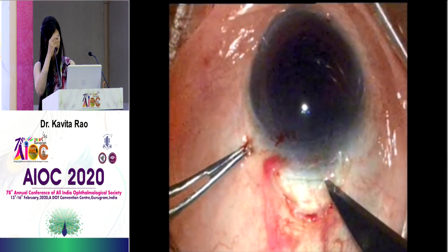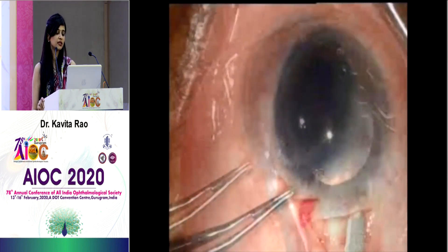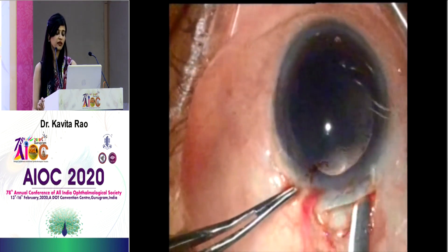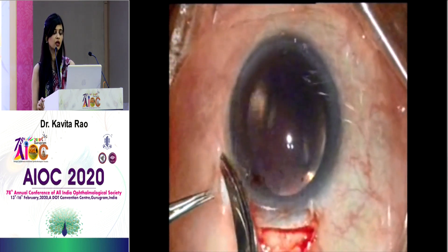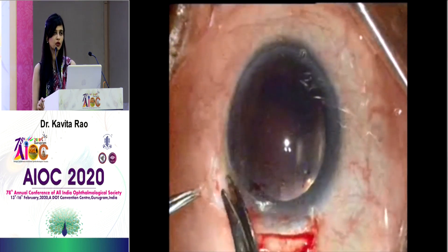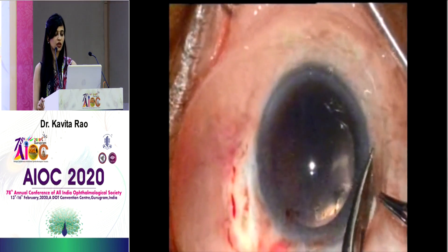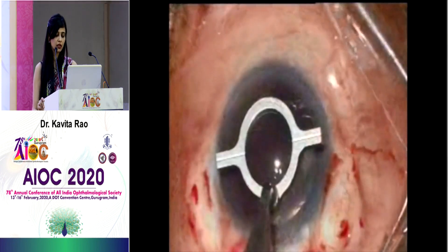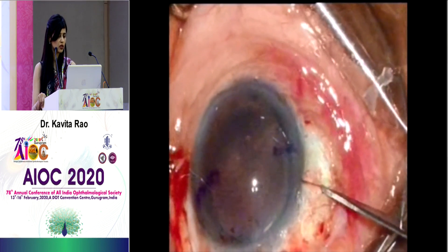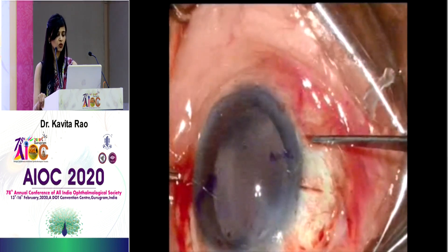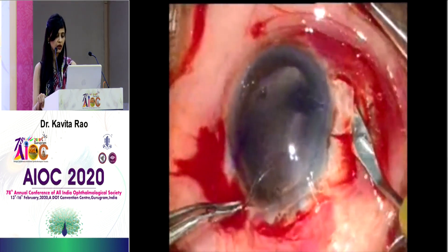The marking I use really helps because you're making your scleral flaps exactly 180 degrees opposite. Dr. Amar Agarwal has also devised a marker that not only marks the points but also the length of the flaps to be made. Here the retinal surgeon is going in to do a vitrectomy.